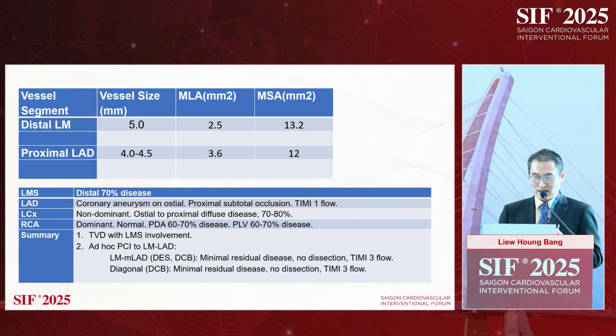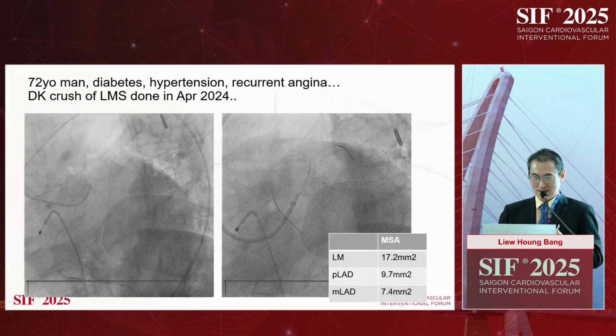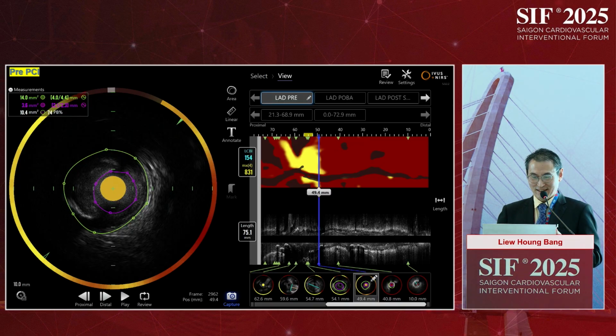I'd like to go back 2 slides here. Sorry, if I can go back, I know time is up. I know 10 minutes is going to cut the slides, right? I just like to show you. See this here? Where the line is cutting, that's the angio and grayscale IVUS-based decision of what is okay for landing.